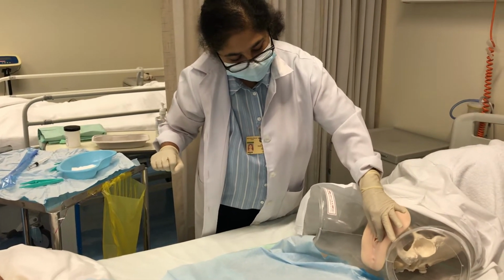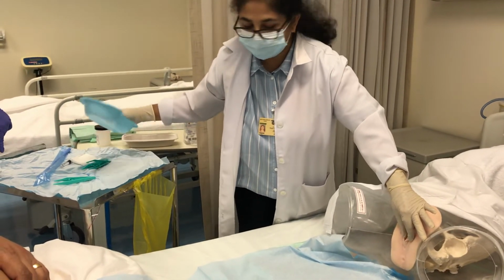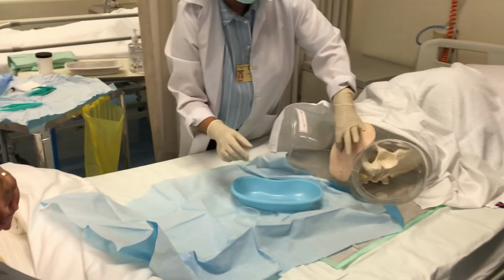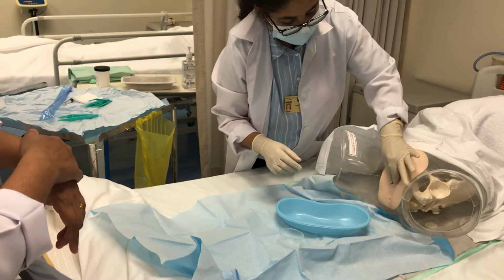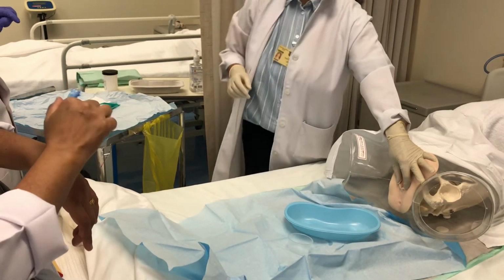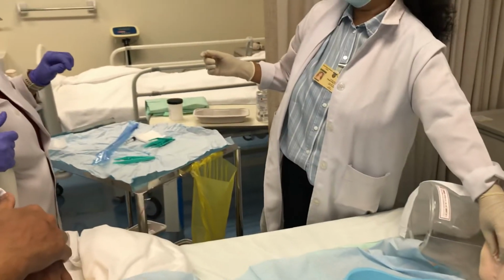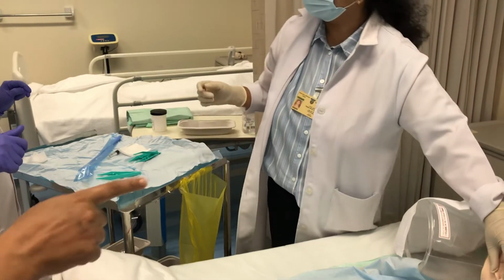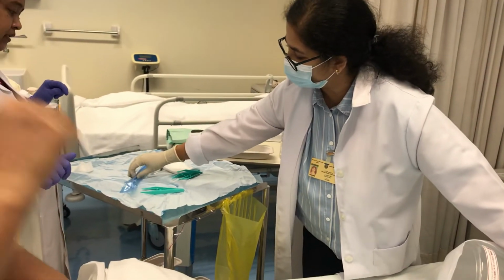So now what is the next step is, we are keeping this face open. We are getting ready to insert the catheter. So we will keep the receptacle here, and we have to now identify the 2 holes, no? What is that? First one is urethral, always urethral. I was telling the students always, the vagina you'll get next. Covered over, very good. Leave the other end.